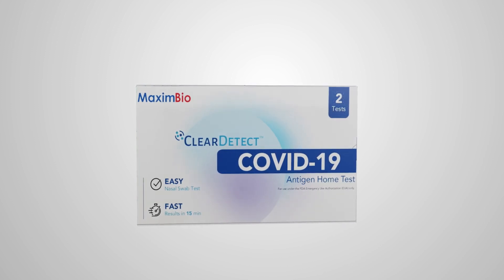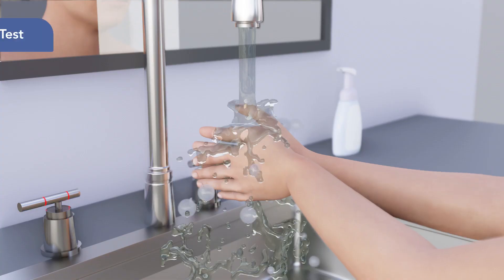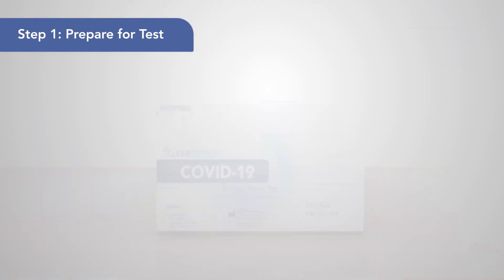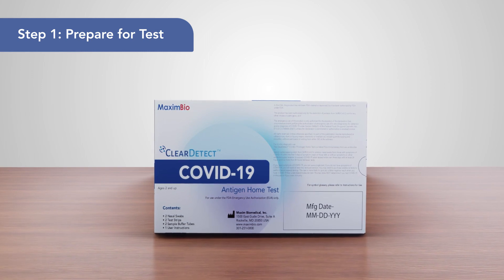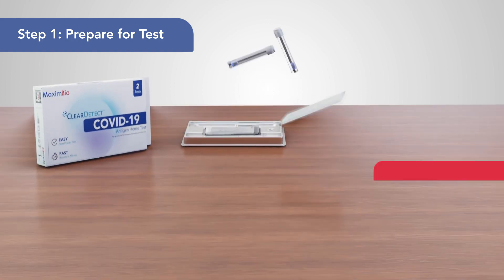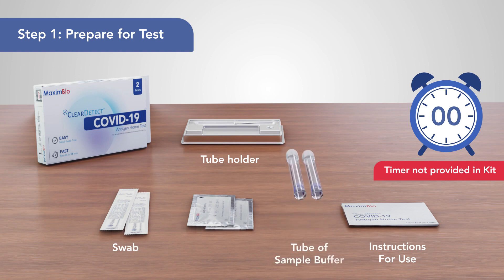Easy steps to perform the Maxim BioClearDetect COVID-19 Antigen Home Test. 1. Thoroughly wash your hands with soap and water. Check the test expiration date located on the back of the kit and ensure that you have all the required testing components laid out in a clean space. To perform a test, you'll need a swab, a tube of buffer, and a test strip.